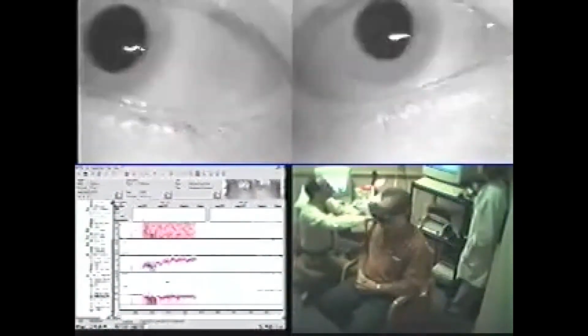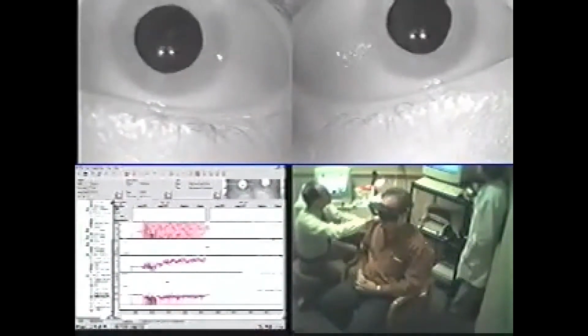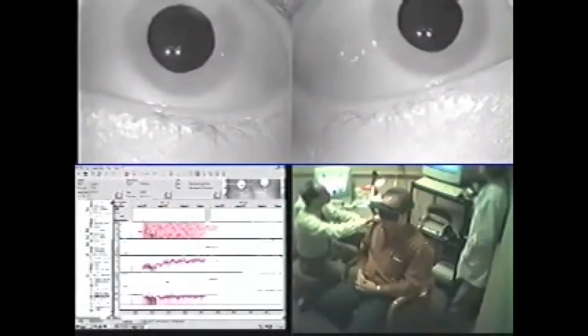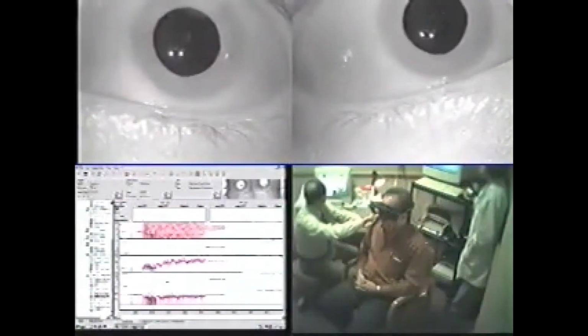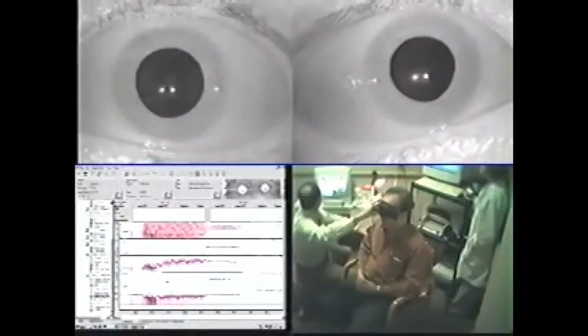Lastly, if the patient would like to complete the active headshake with their eyes closed, that is okay. It is the post-headshake window that is important. About 3 to 5 seconds before they stop shaking their head, have them open their eyes so the camera can capture any post-headshake nystagmus.